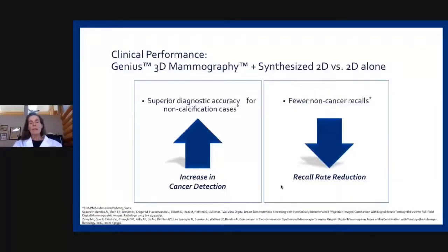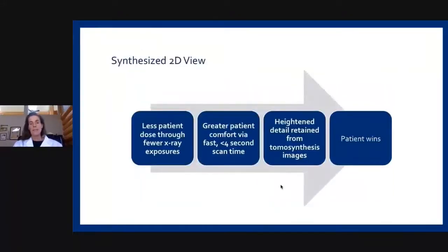So looking at how it performs, we know that using the 3D mammogram and a synthetic 2D does better than a 2D alone. We are increasing our cancer detection and again, reducing our recall rate. So again, for all those reasons, we feel like this is really a good direction to go for our patients, utilizing the synthetic 2D view.